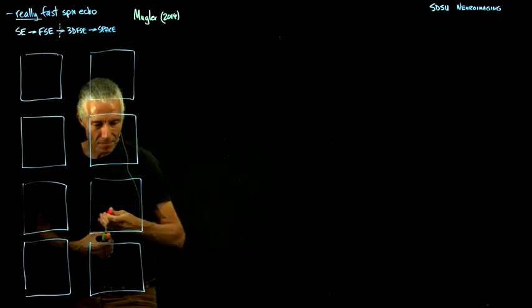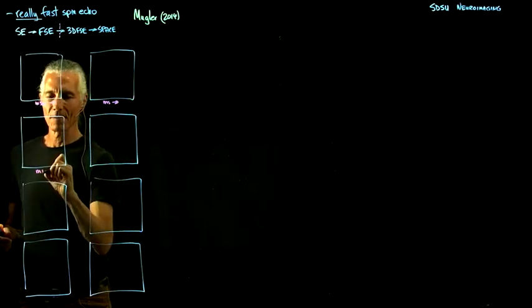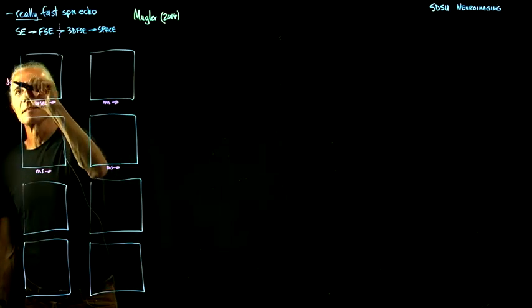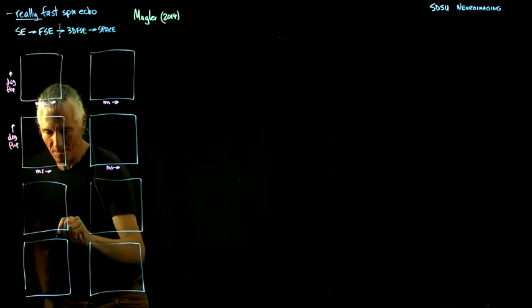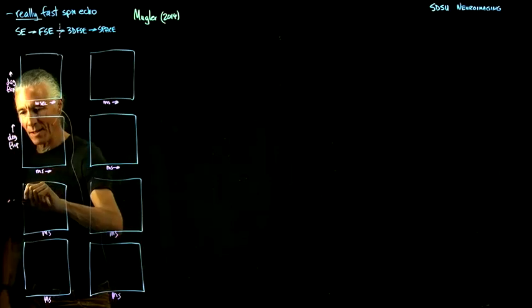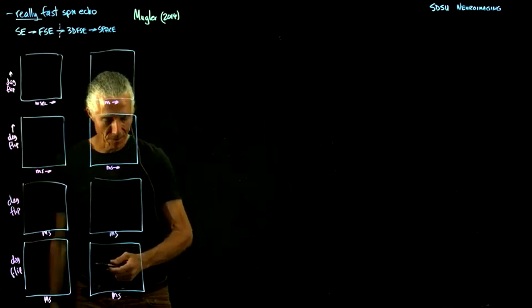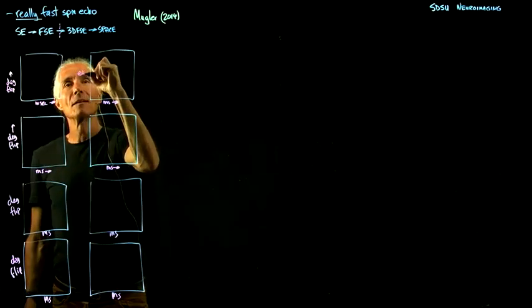In each case, this is milliseconds here. So time's going that way. And on the other axis is the flip angle, in degrees. So the first thing that we do is, what happens if we just do 180s. There are two axes, milliseconds and degrees of flip angle. And what I'm plotting on this side is the echo amplitude.